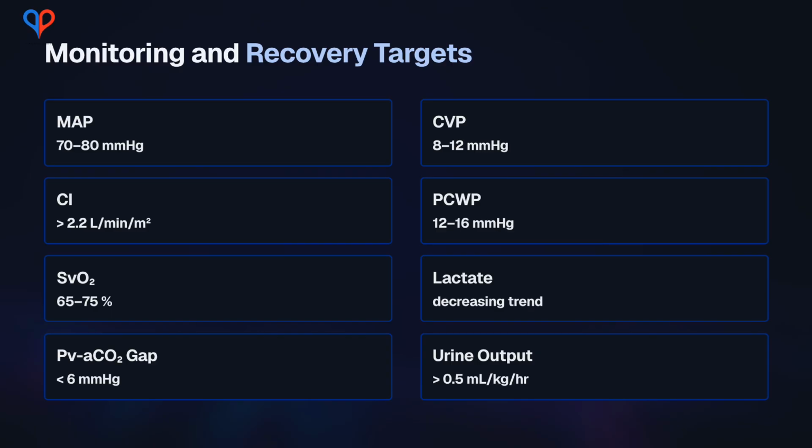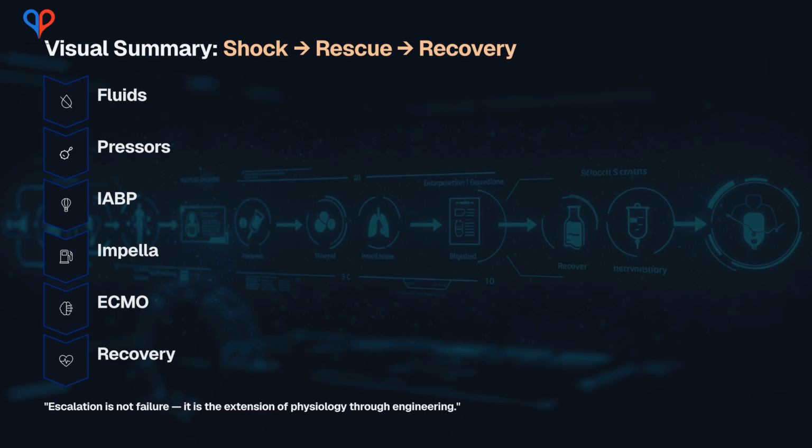Mechanical circulatory support is not a failure of medicine. It is the continuation of physiology through engineering. It preserves oxygen delivery and systemic perfusion while the heart and microcirculation recover.